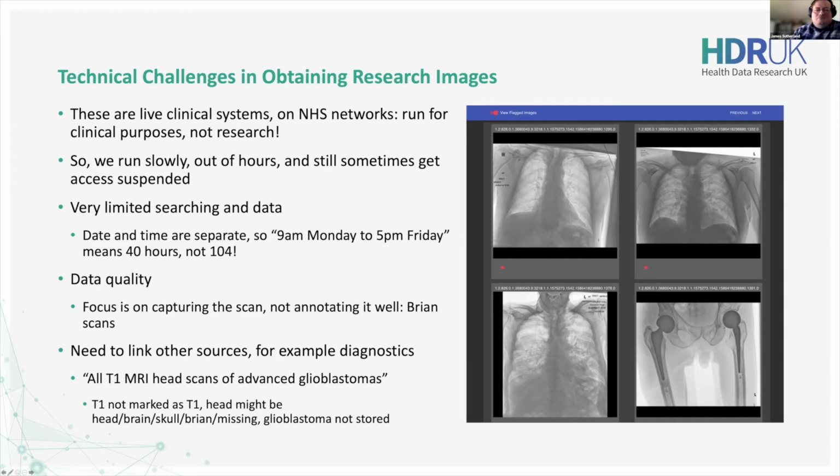Now, the other issue, once you do get access to the scans and you manage to retrieve the scan, you may find the priority is on clinical usage. So, for example, a radiographer is focused on getting a good quality, usable X-ray or CT scan of the patient and getting it to the doctor who asks for it as quickly and efficiently as possible. They don't tend to put much effort into, for example, annotating it.